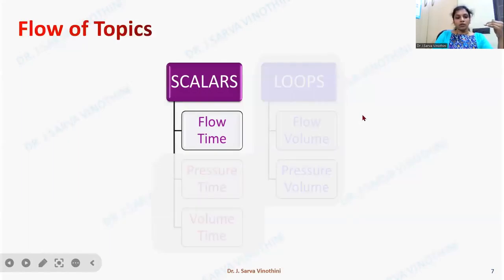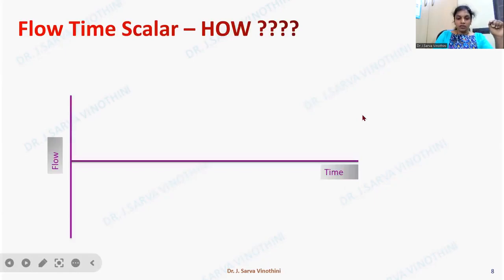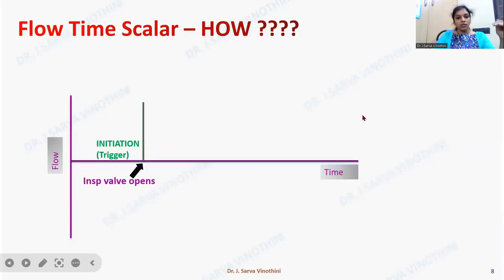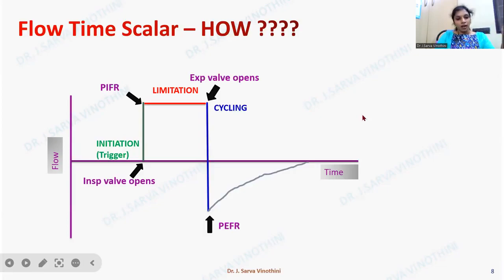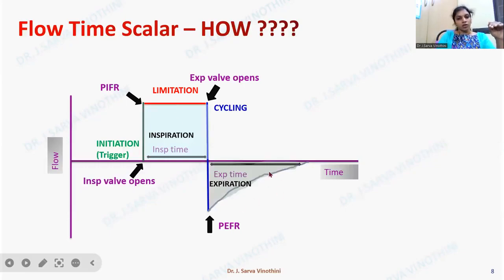Let us first take the flow-time scalar. Flow is plotted on the Y-axis and time on the X-axis. When the inspiratory valve opens, air is sent from the machine to the patient — this is the trigger that initiates the breath. A peak inspiratory flow rate is achieved, the flow gets limited there, then the expiratory valve opens, the inspiratory valve ceases, and expiration occurs. The peak expiratory flow rate is generated. This inspiratory portion and this expiratory portion make up the inspiratory time and expiratory time.